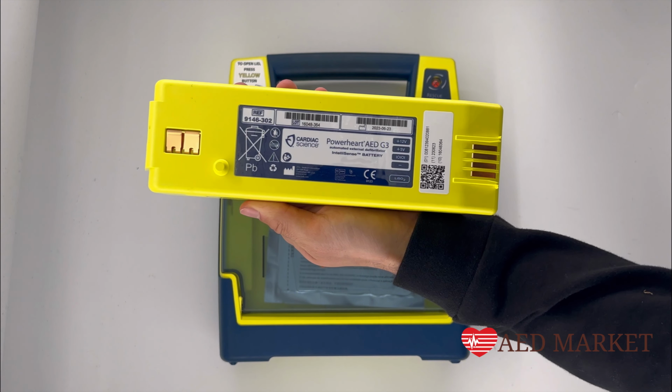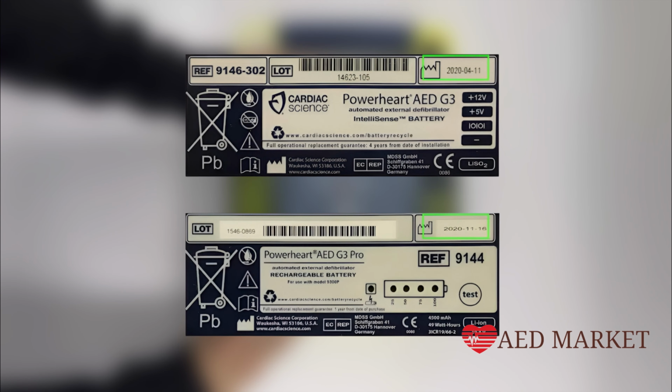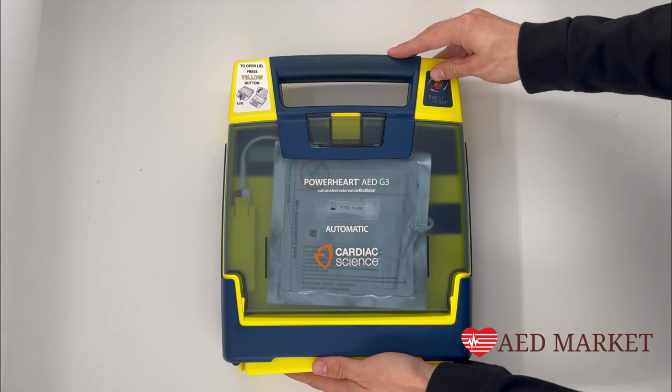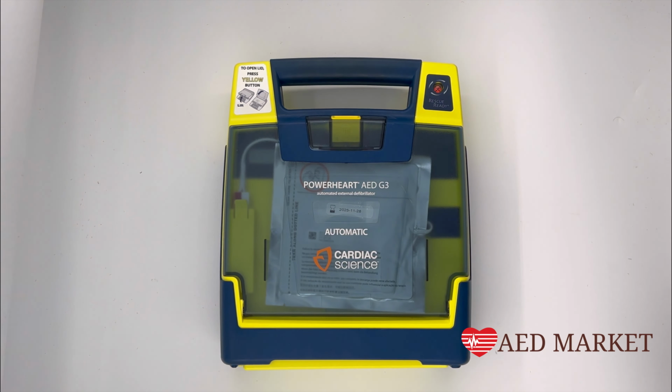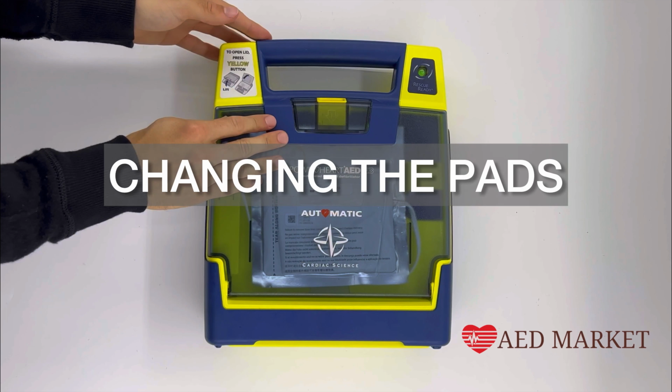On the battery, you will find a reference number, a lot number, and a date, which indicates the date of manufacture. This battery comes with a 4-year full operational guarantee, starting from the moment you install the new battery in your AED. Now let's move on to changing the pads.